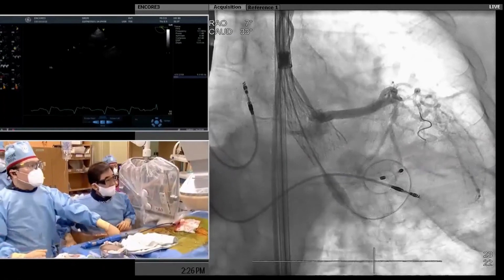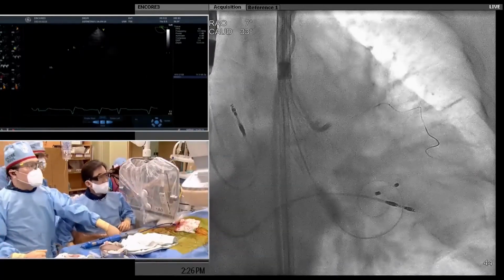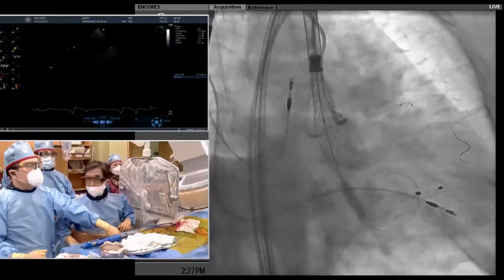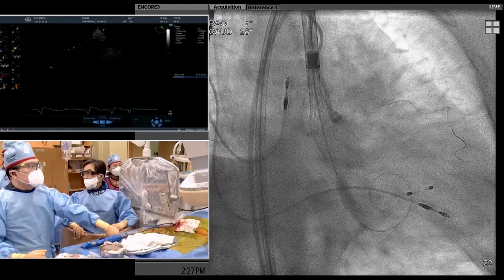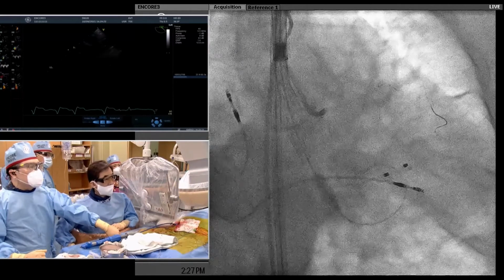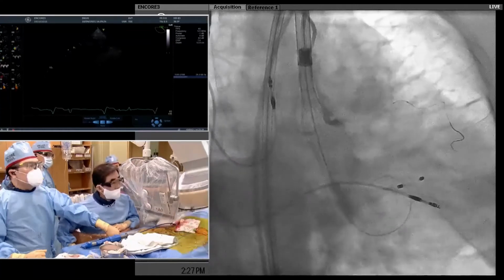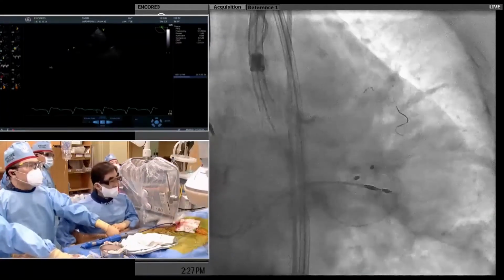Okay, just 앵글을 좀 바꿔볼까? I think if you deploy the valve, the coronary flow is maintained. 한전수 앵글 알잖아. The reason why the coronary flow was engaged by the catheter is that the space is connected, capable to supply the coronary blood flow.